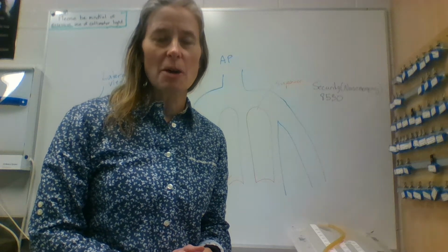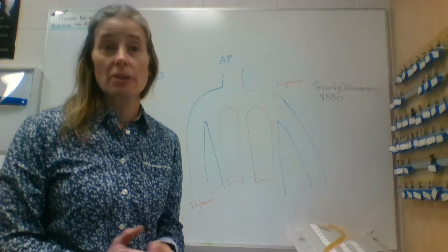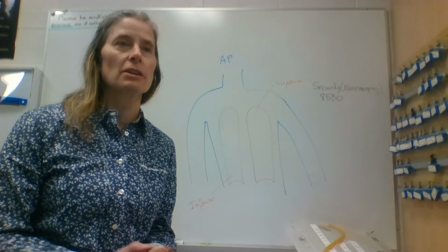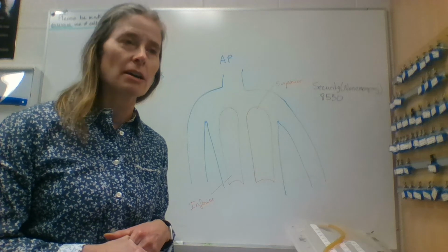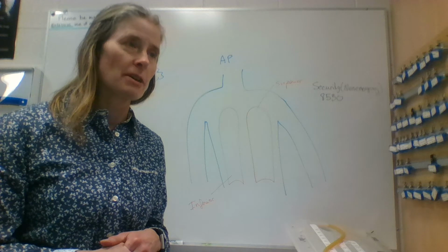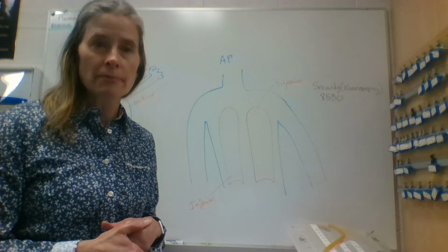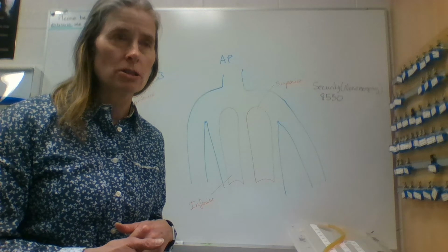Okay, we're going to talk about chest tubes. And when it comes to chest tube insertion, there's a couple of reasons why a patient may need a chest tube insertion. A lot of the patients in Emerge who have suffered any kind of thoracic injury may require a chest tube insertion. That's because they've suffered a pneumothorax, or perhaps it's a hemothorax where there is blood in the chest cavity. Perhaps there's been an injury to some of the great vessels off of the heart or chest itself.